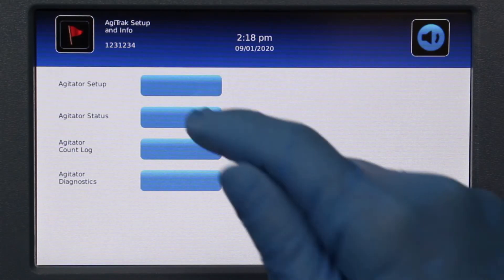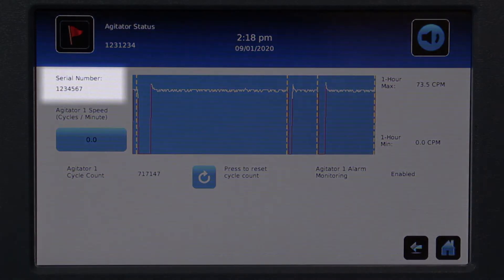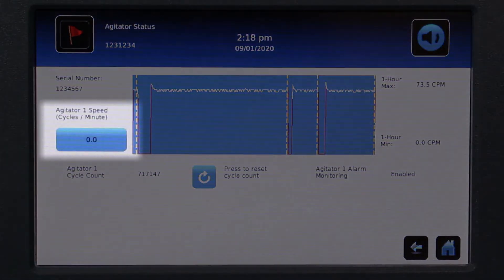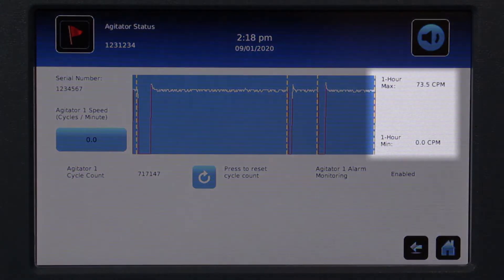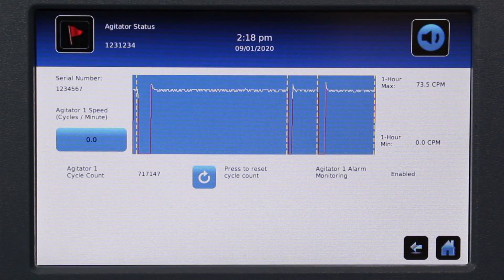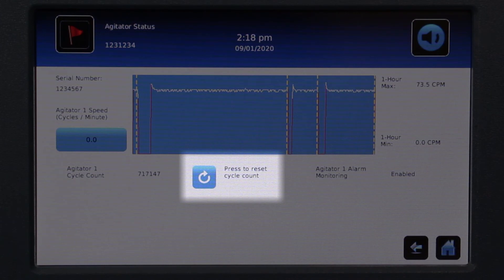The Agitator Status screen provides real-time information regarding the agitator speed and cycle count. This includes serial number, speed, and maximum and minimum speeds within the last 60 minutes. The cycle count can also be reset.